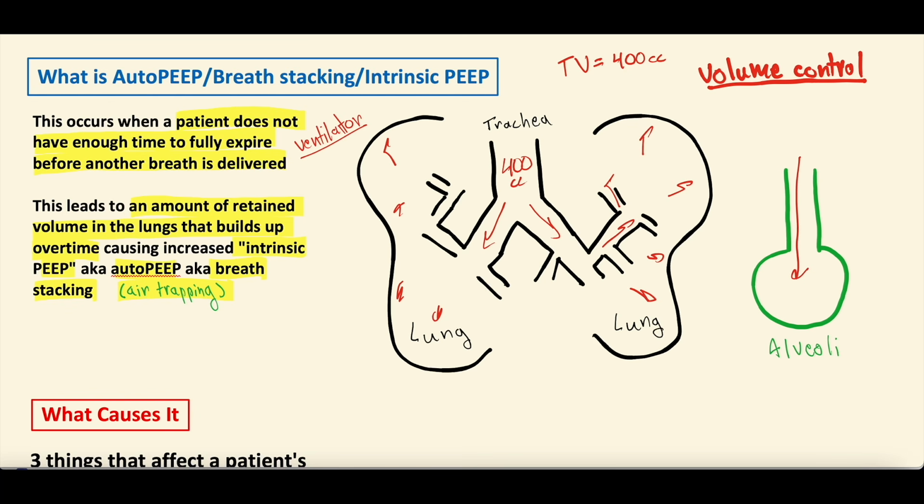They expire. And what happens in a normal physiology of the lungs, or a ventilator that's well set up, is when the patient expires, these lungs move inward and they push all the air back out, and that air travels up the alveoli, into the small airways, into the large airways, into the trachea or windpipe, and then out of the patient.